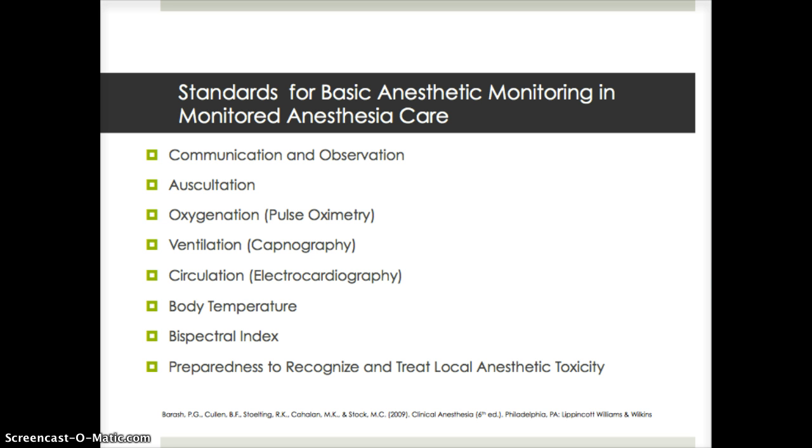During all anesthetics, the use of a quantitative method of assessing oxygenation, such as pulse oximetry, is specifically mandated by the ASA standards for intraoperative monitoring. At the very least, patients must be assessed for qualitative signs of ventilation, such as observed chest excursion or auscultation of breath sounds. Capnography is most effective in the intubated patient, but side stream capnographs have been adapted to use with face mask and nasal cannula.